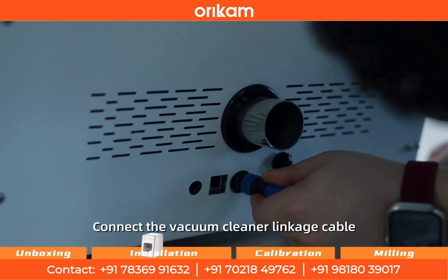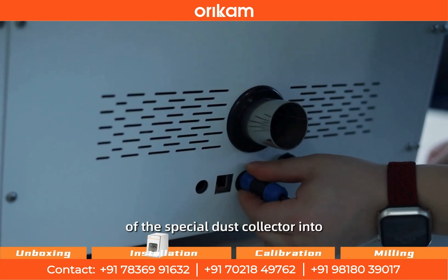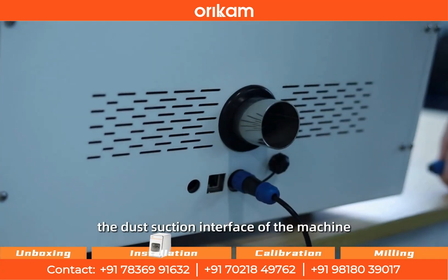Connect the vacuum cleaner linkage cable and insert the vacuum cleaner hose of the special dust collector into the dust suction interface of the machine.